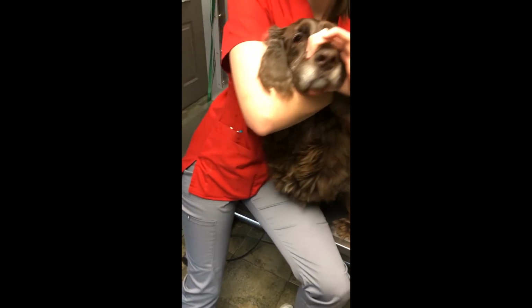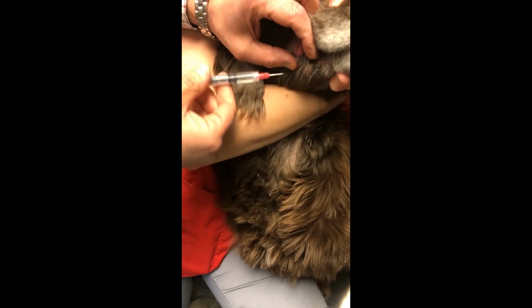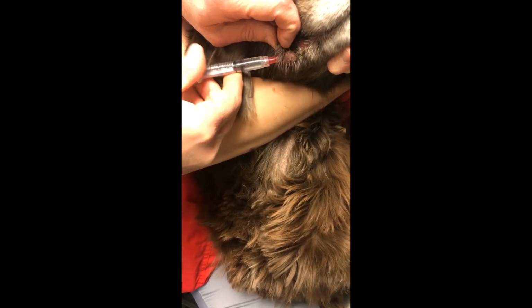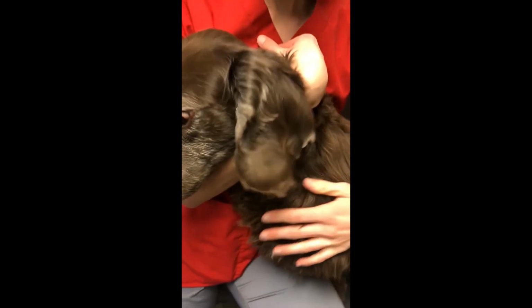Elbow up, Heather. Thanks, Heather. And we're going to need to shave this. We didn't shave it. So after I put the lidocaine in, we'll give it a little shave, let the lidocaine work.